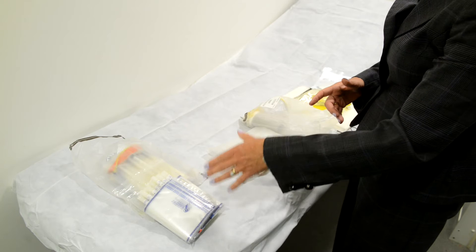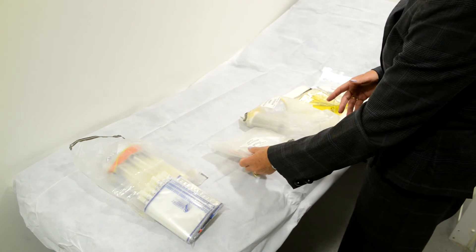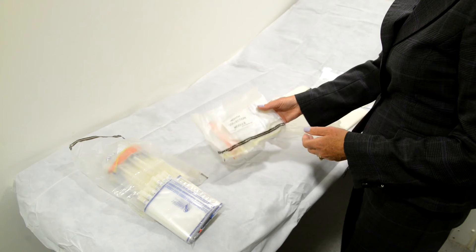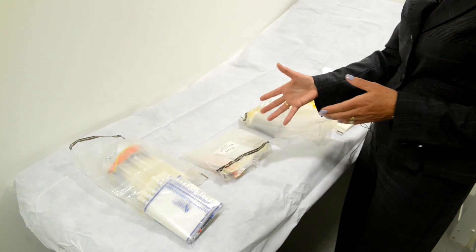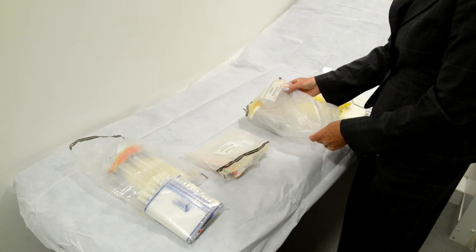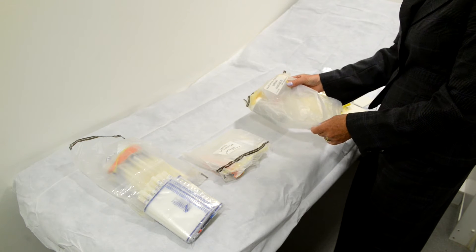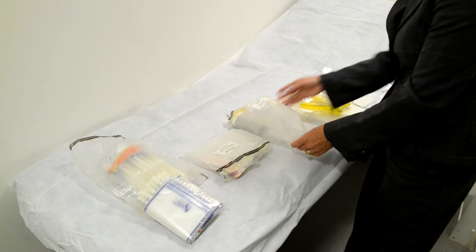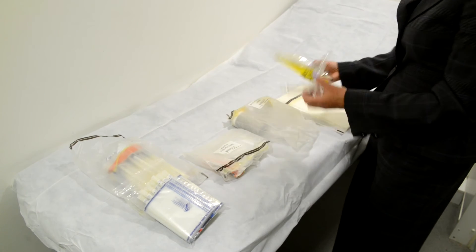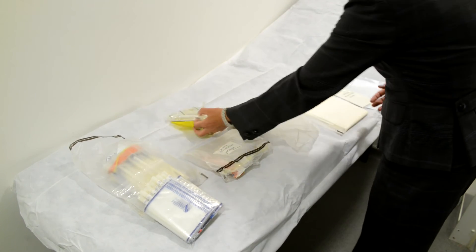Lots of swabs are included because a lot of swabs are always taken. Within the kit we have the mouth collection module for allegations of oral intercourse. We have an alcohol and drug urine module, which is important to collect the urine to demonstrate alcohol or drugs in the system, and of course the disposable speculums that are used in conjunction with the swabs.